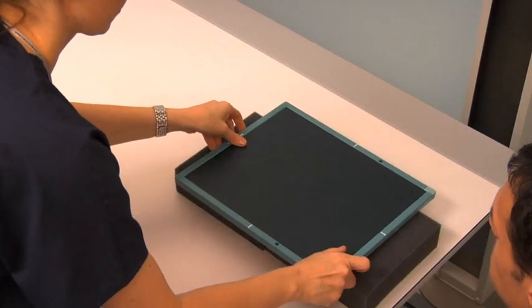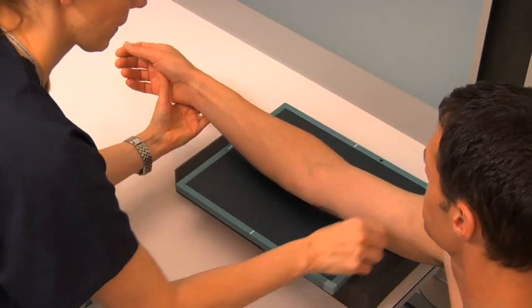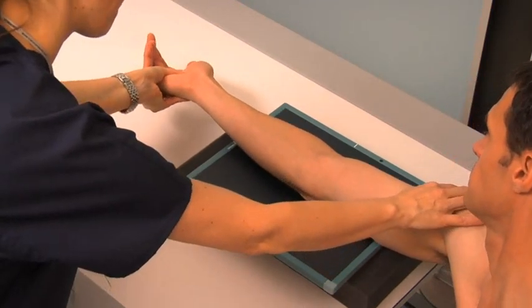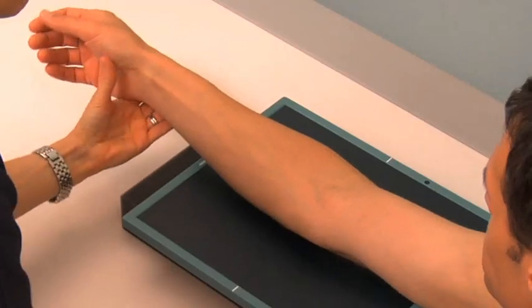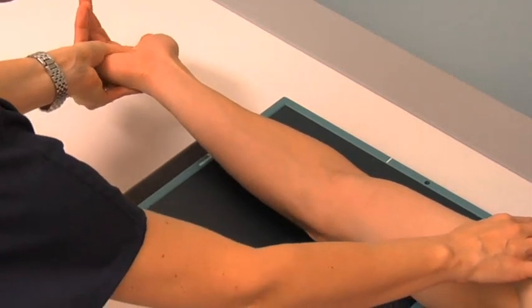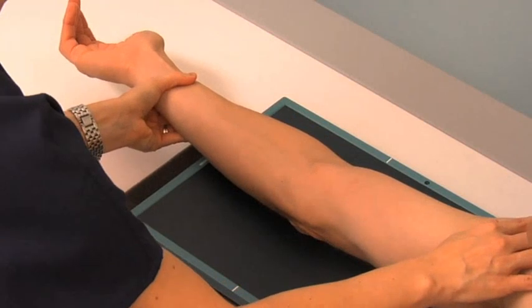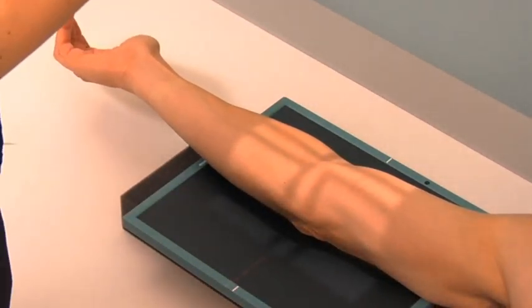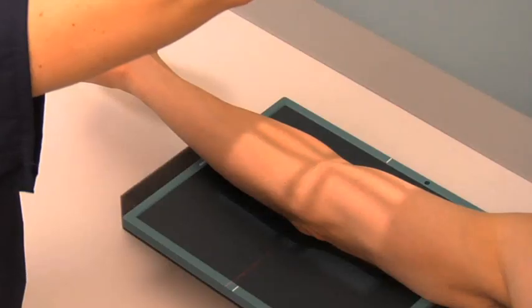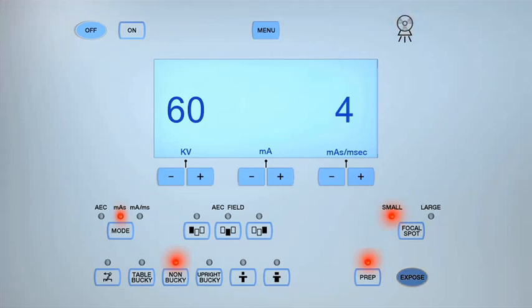To obtain an oblique projection of the elbow with lateral rotation, place a new cassette on the tabletop. Ask the patient to extend their arm fully, resting the posterior aspect of their humerus and forearm on the cassette. Roll the patient's arm laterally until their humerus, elbow joint, and forearm are at a 45-degree angle to the cassette. Center the central ray to the midpoint of the elbow. Collimate to include the same anatomy as the AP and lateral elbow projections and expose the cassette. Review the images for these projections.